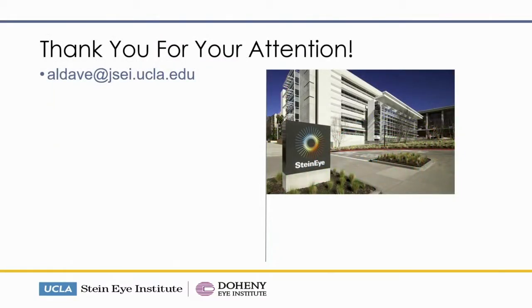So in summary, the workup of the patient with irregular astigmatism in whom you're planning cataract surgery, the preoperative evaluation should include topography, should include slit lamp examination with oblique illumination and OCT on occasion. And then if it's a surface disease, it should be managed preoperatively, and if it's stromal disease, it may be managed in selected cases intraoperatively. Thank you very much for your attention.